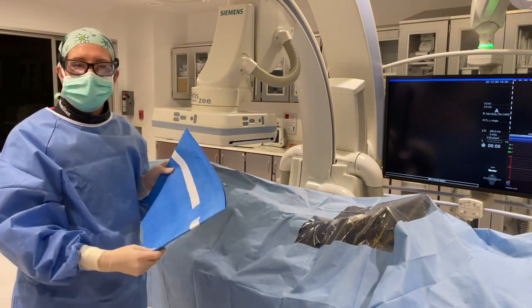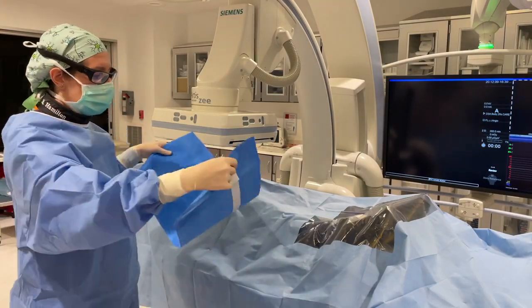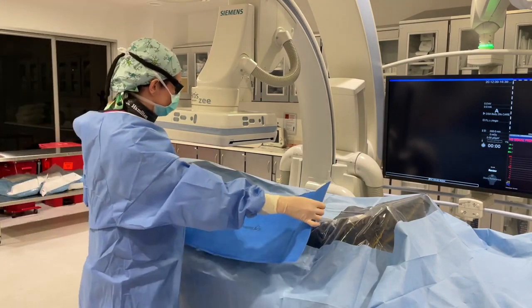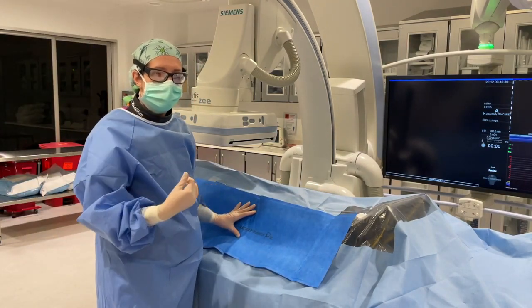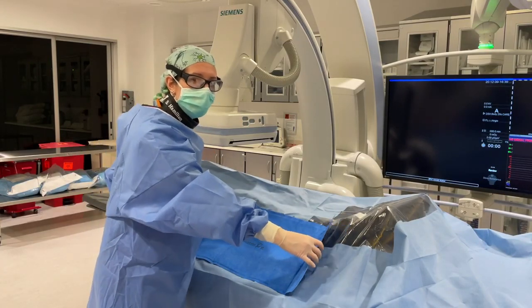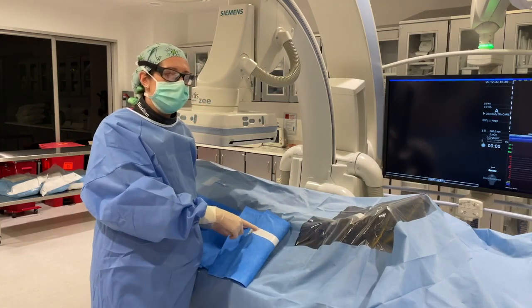When we're working in the lower extremities, as in the case of a peripheral artery disease or a venous disease case, you can use this elongated RADPAD to protect yourself and the staff from scatter radiation. So when working in the left lower extremity, you can place the RADPAD on the right leg, and this will provide scatter protection to the operators. If you are going right down the right leg, you just need to move the drape laterally so that it's not encroaching in the image field of view. And this adhesive backing helps to keep it in place if you're more lateral.